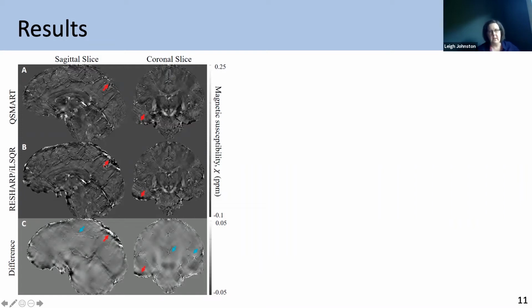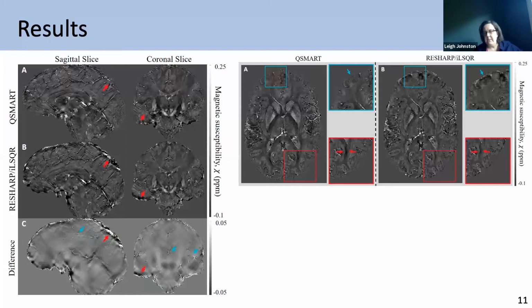It is literally, if you do these masking things properly and take out the artifacts by a principled physics-based modelling method, it actually makes sense, and it really does work. And you can see that in the difference images below. And if you'll also note, in the difference images, I think you'll see something of a cross, kind of a streaking cross-shaped artifact. That's all due to the shape of the dipole kernel in the Fourier space. And so we know that if we're cleaning up our images, we're getting rid of some of that dipole-shaped artifact, which is good.